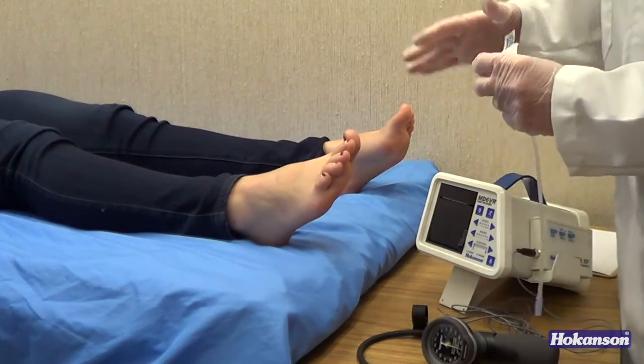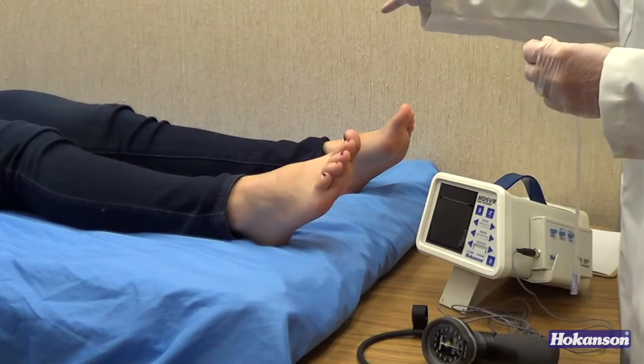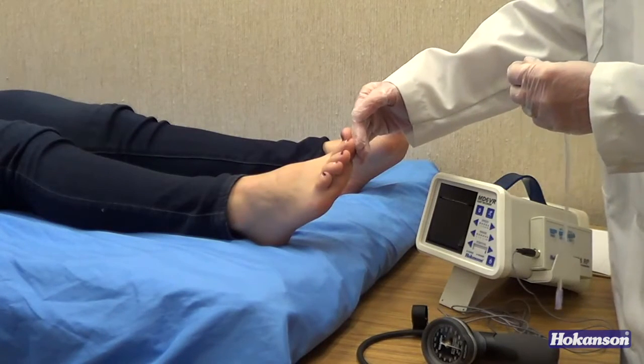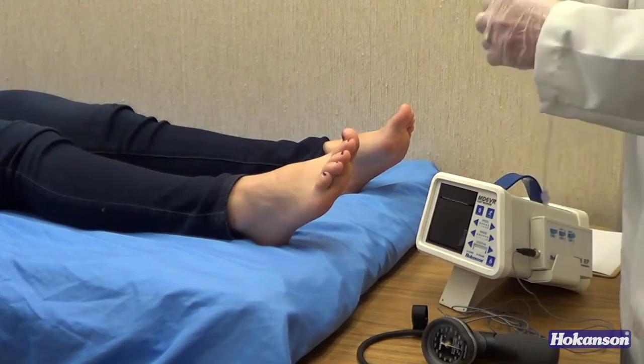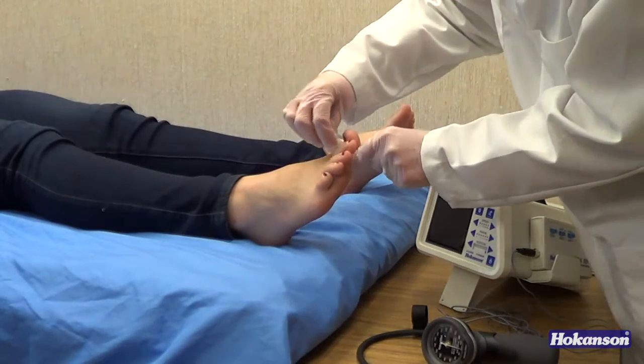So we want the patient to be supine, comfortable, and warm. The feet should be warm in order to take the toe pressure. That ensures that you'll get a sufficient waveform.